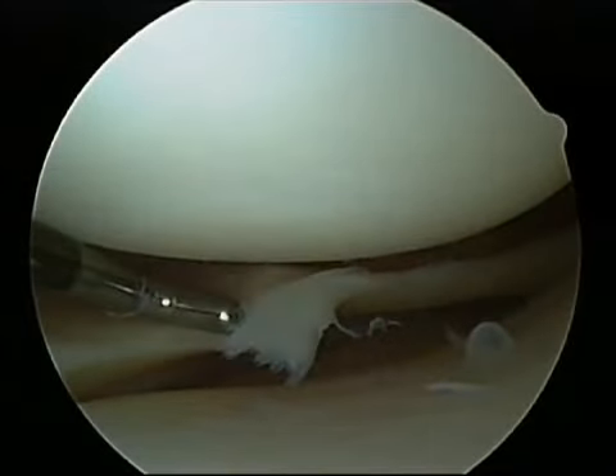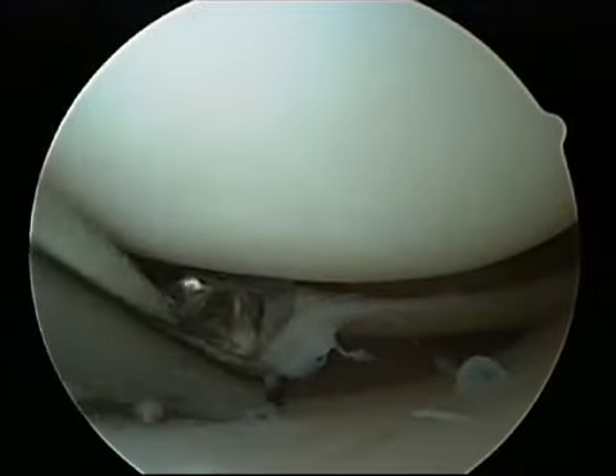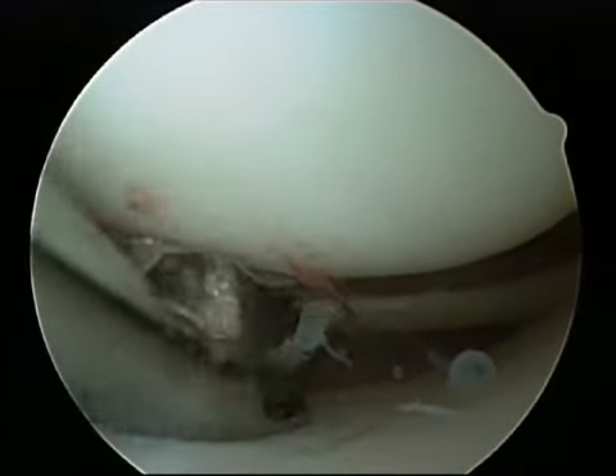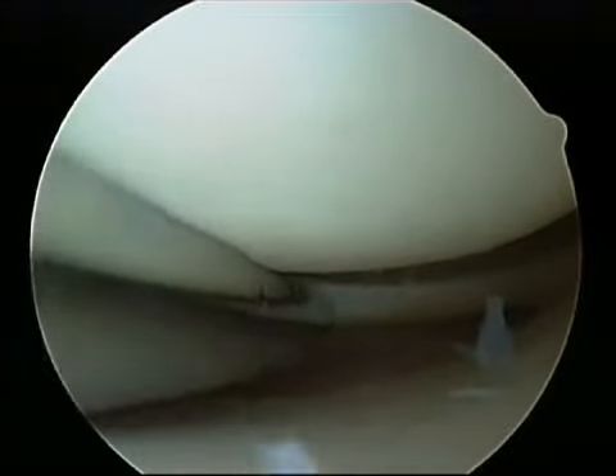This is an example of a small meniscus tear that is unstable to probing. A special instrument can be inserted to remove the unstable tear, and the shaver helps clean out the pieces and smooth off the edges of the meniscus.